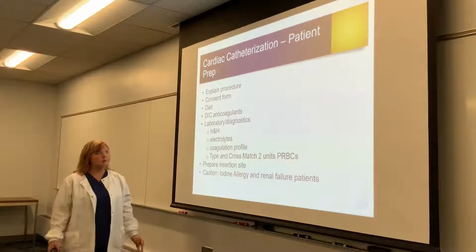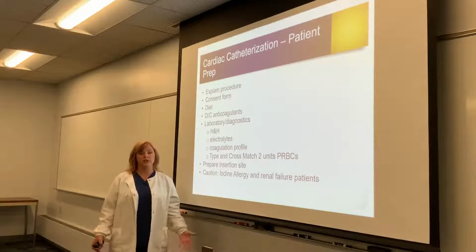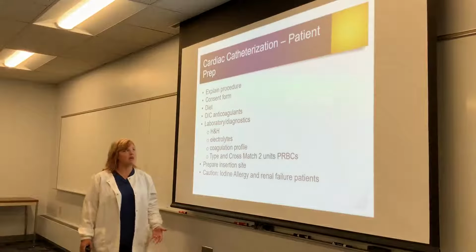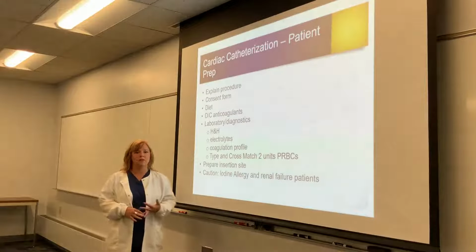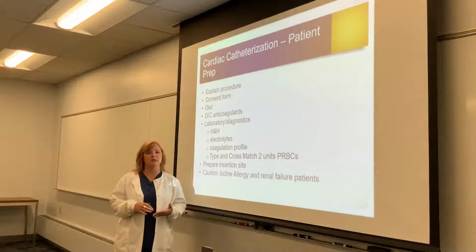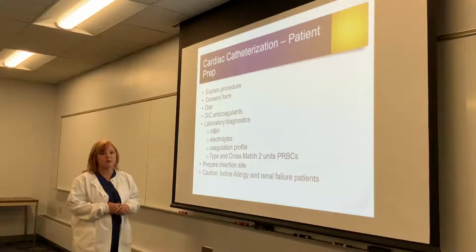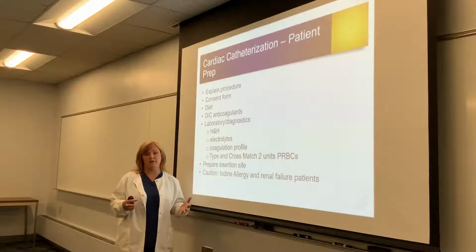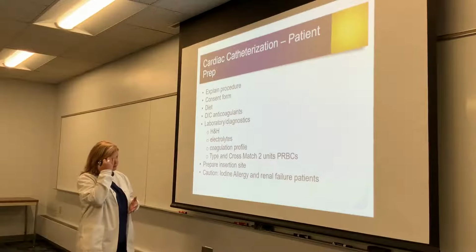So thinking about prepping the patient beforehand, they'll have to be told the procedure, they'll sign a consent form. That will be the responsibility of the cardiologist. They'll have to know information as to when they need to be NPO, when they should stop any medication such as anticoagulants, if they're diabetic, do they take their insulin, those types of things. They'll also have pre-op lab work done, and that might be done the day of the procedure, or the provider might have ordered it prior to the procedure. It just depends on that particular provider.